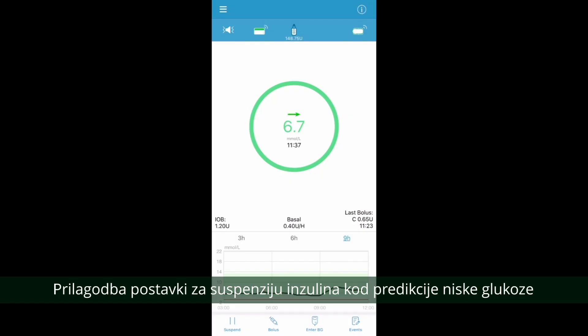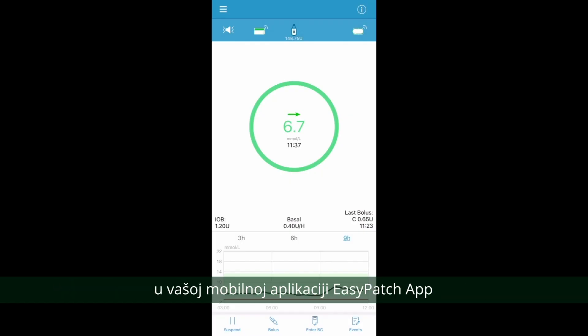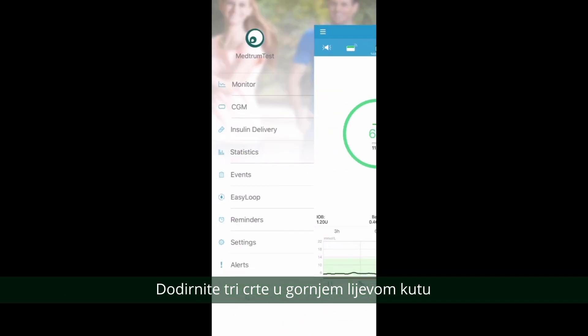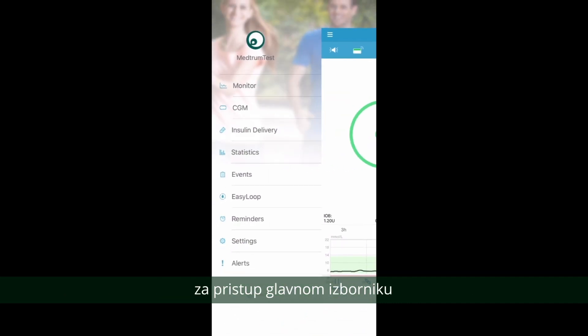To set up your Predictive Low Glucose Suspend on your EasyPatch app, tap on the three lines in the top left hand corner to access the main menu. Tap on Easy Loop.